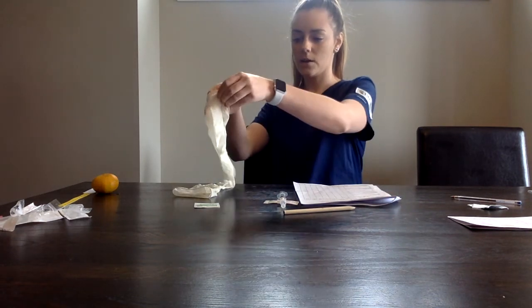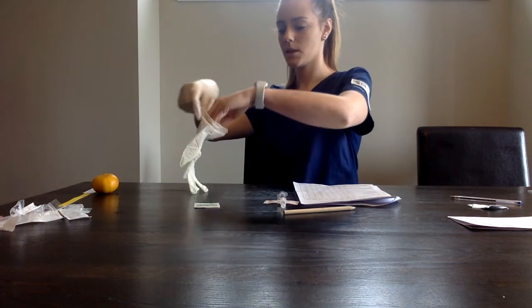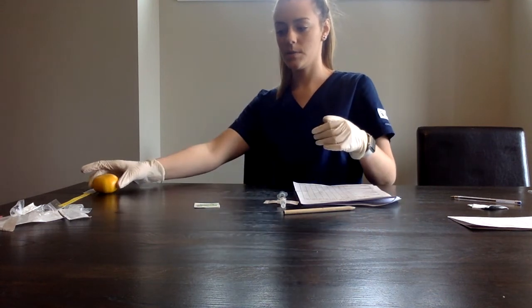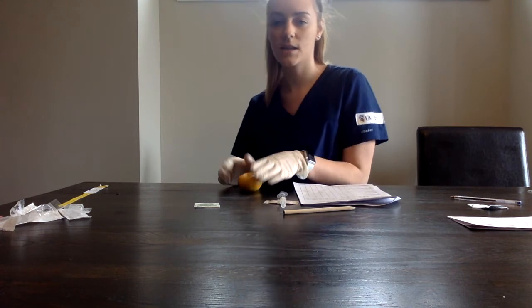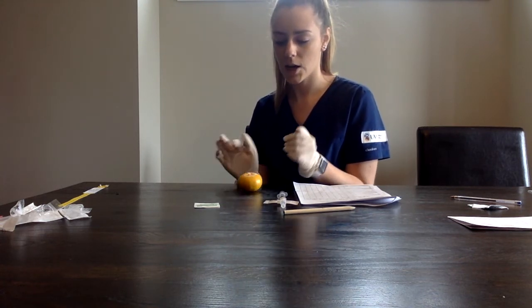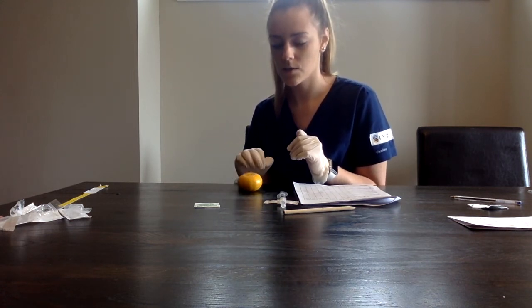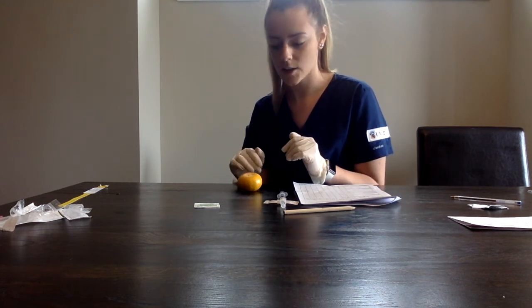So I'm going to do hand hygiene, and we'll put on a pair of clean gloves. So for landmarking this injection site, we want to be doing the injection 5 centimeters away from the umbilicus, either to the right or to the left works. But we also want to inspect the area just to make sure there's no areas of bruising, and if there is areas of bruising, picking a different site other than that area that had the bruises.